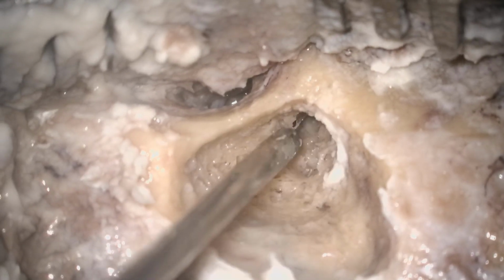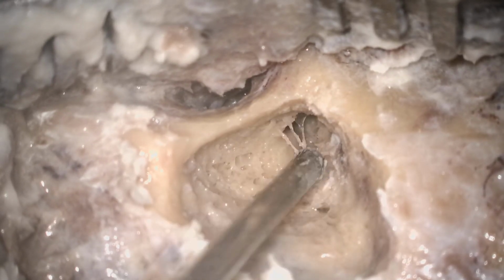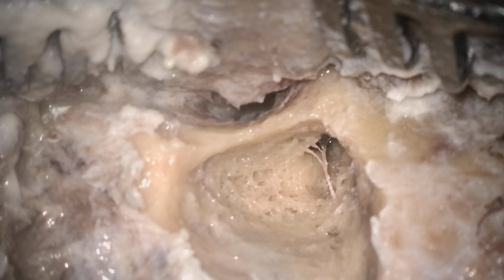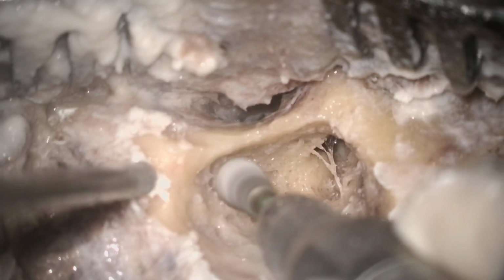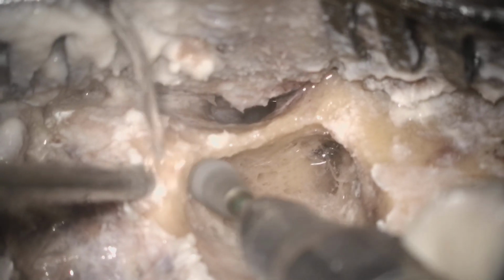So suppose you are doing a cochlear implantation, and in that case you have to make the canal wall just like paper thin, okay, because otherwise you cannot visualize the middle ear through the posterior tympanotomy, and you cannot approach the round window area. So the thickness of the posterior canal wall depends on the situation, according to the surgery you are doing. Okay.